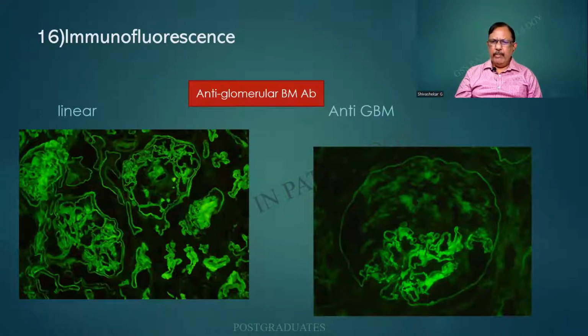Immunofluorescence is of paramount importance in glomerular pathology. We are not pioneers. Maybe some centers you are routinely seeing nephropathology. But then remember these two things, dear students. One, it can be granular, or two, it can be linear. Granular is when there are going to be patchy areas of deposits, which are later on identified by means of immunofluorescence.